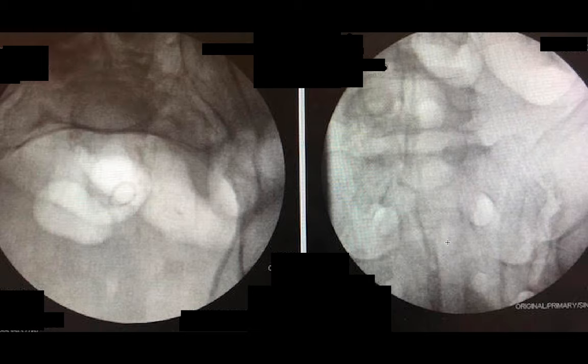He just seems to have a very small pelvis to begin with. But I also felt that putting a transiliac transsacral screw would just not be in the right trajectory when it came to the fracture, and really what this needed was a true SI screw.